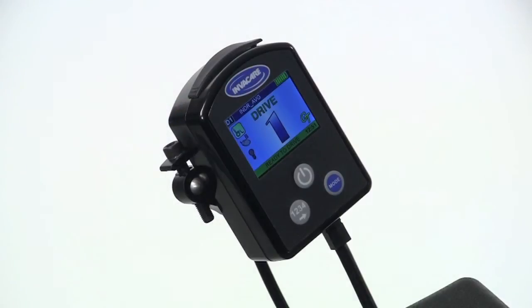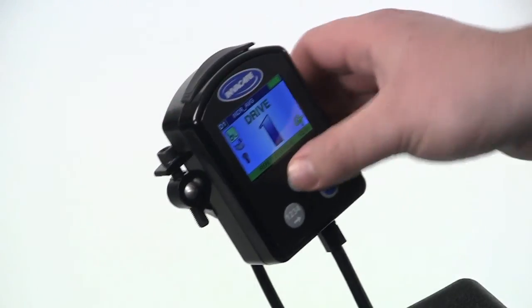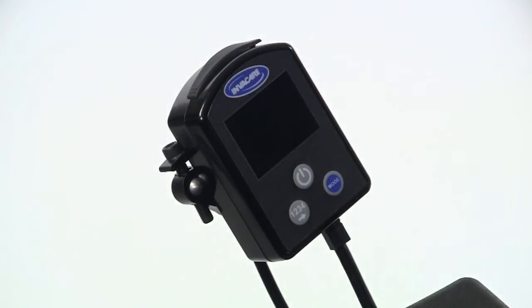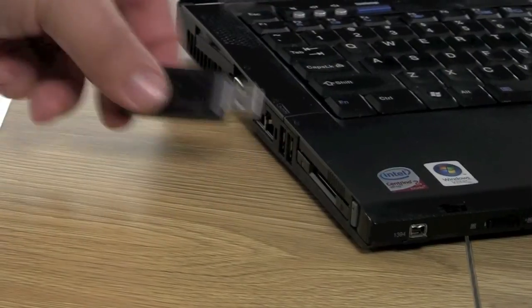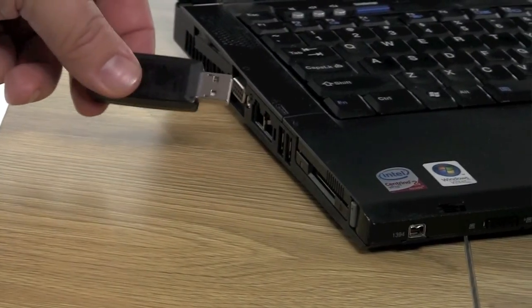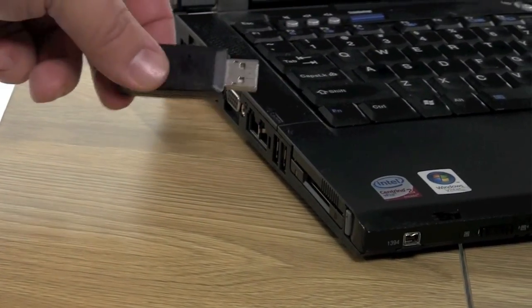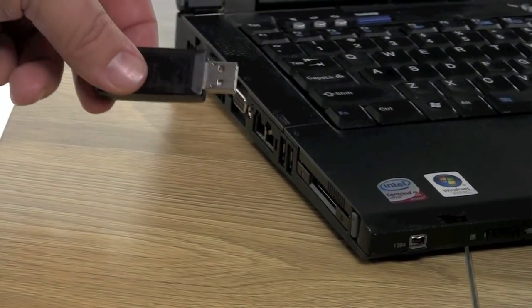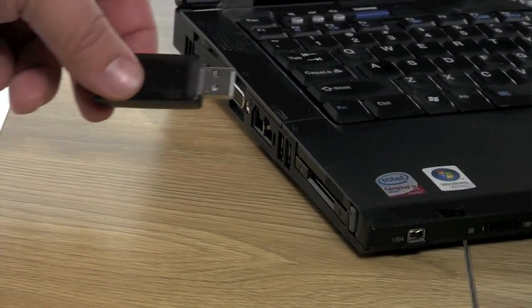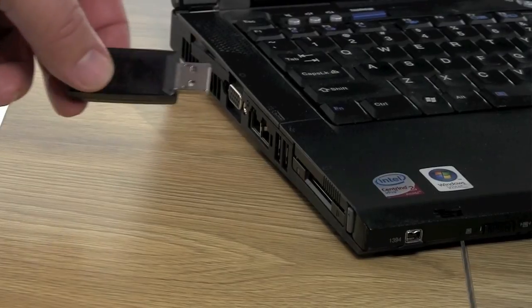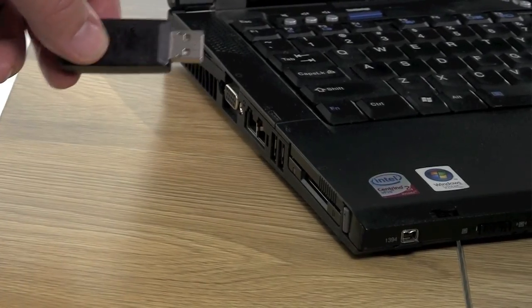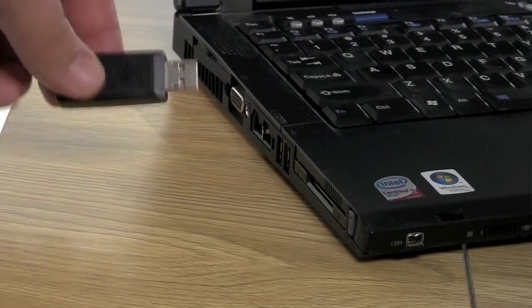First, turn the power wheelchair off. Next, take your USB mouse dongle and insert it into the USB port of your laptop, PC, or AAC device.